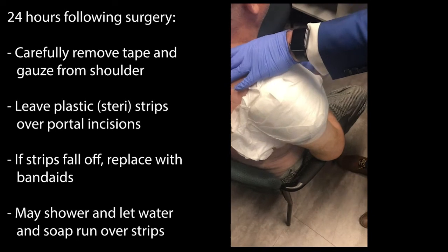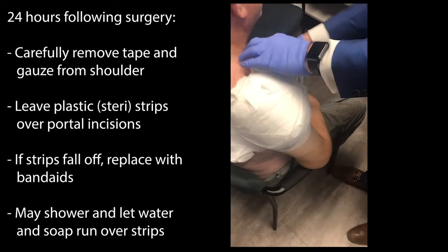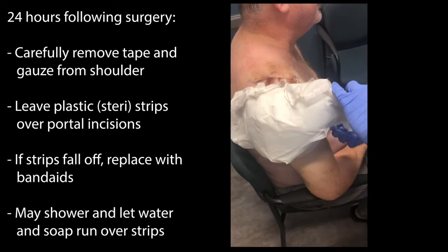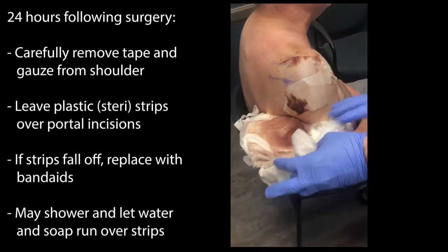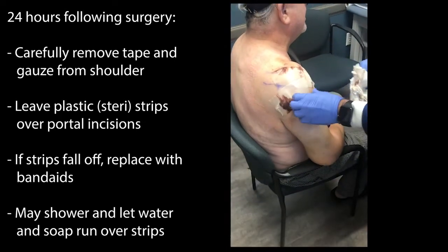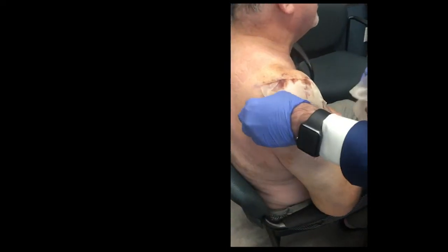Removing that tape can be kind of uncomfortable because it is quite sticky. That usually will bring all of that gauze, with some very slight bleeding that can happen through the incisions, off with it.